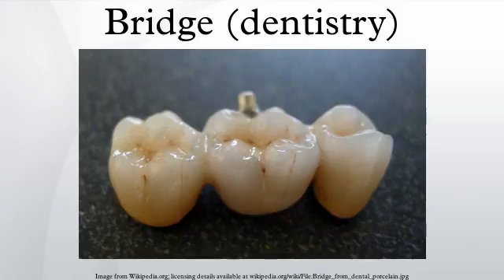A bridge is fabricated by reducing the teeth on either side of the missing tooth or teeth by a preparation pattern determined by the location of the teeth and by the material from which the bridge is fabricated. In other words, the abutment teeth are reduced in size to accommodate the material to be used to restore the size and shape of the original teeth in a correct alignment and contact with the opposing teeth. The dimensions of the bridge are defined by Ante's law.